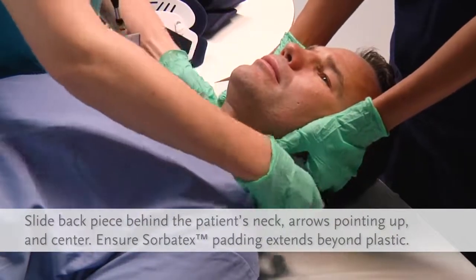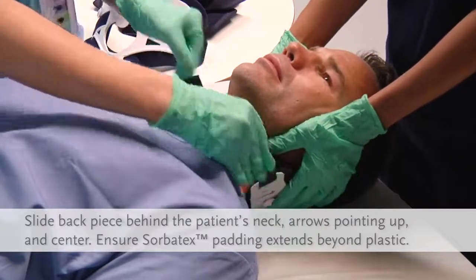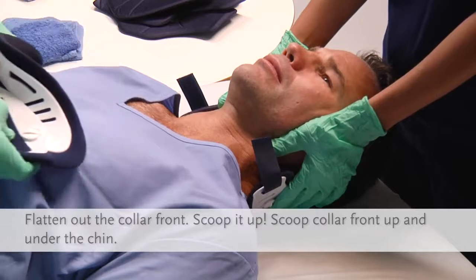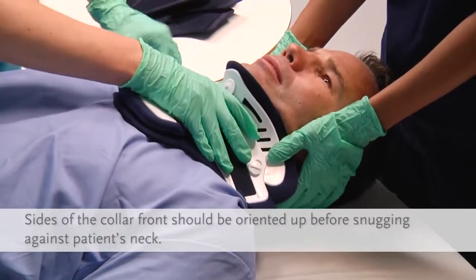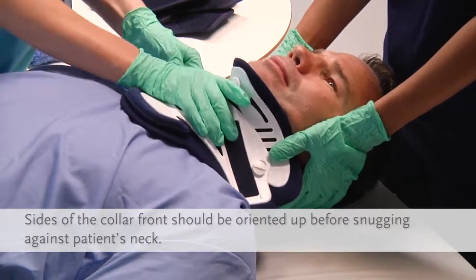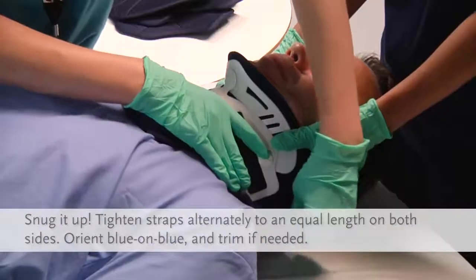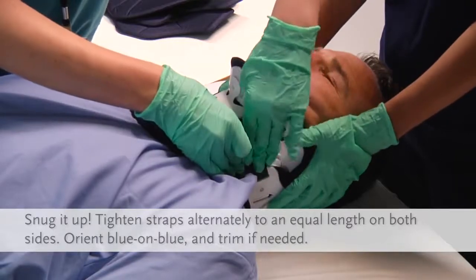Slide the Miami J back piece behind the patient's neck and center it. Ensure the blue Sorbitex padding extends beyond the edge of the plastic. Flare the sides of the collar front out, slide it up the chest wall, and scoop it up under the chin. Curl the ends snugly against the patient's neck. The sides of the collar front should be oriented up off the trapezius and towards the ears. Secure the Velcro straps, then tighten straps alternately, one at a time, to an equal length on both sides.